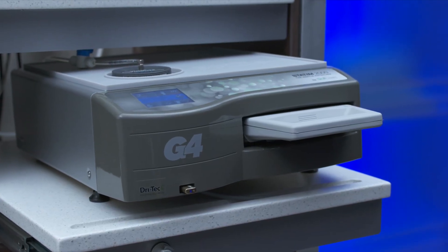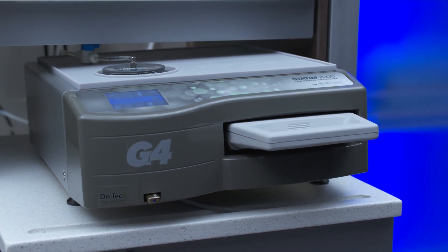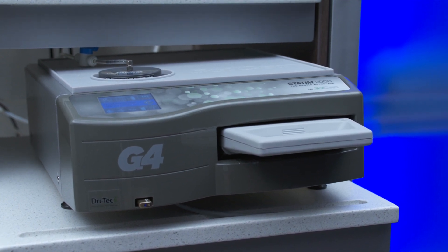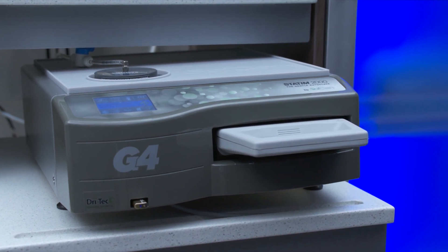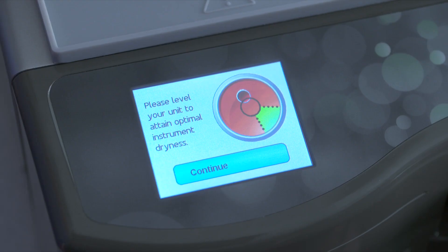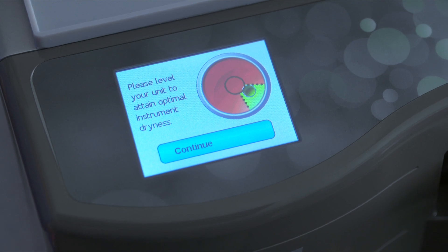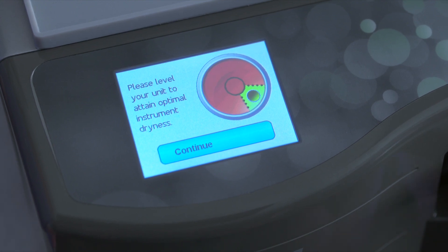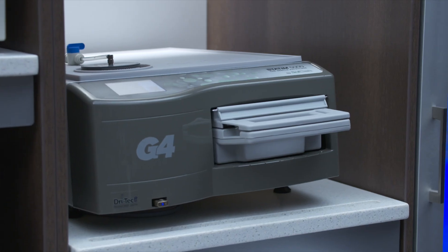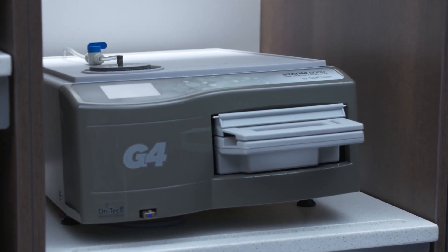When placing your unit on a countertop, ensure it is stable and that all 4 feet are securely in contact with the counter surface to prevent the unit from moving freely. Power on the unit using the switch found at the back left of the unit. After powering on, the STATUM digital bubble level will appear. Please adjust the leveling leg so that the bubble level is in the 4 o'clock quadrant. The diagram will turn from red to green to confirm that the STATUM is properly leveled.